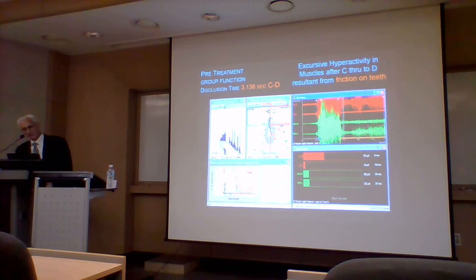And in this version of the T-scan, the posterior teeth are in purple, the purple quadrant. And here again, the patient bites down, holds their teeth together, slides to the right, and you see the purple quadrant never discludes.